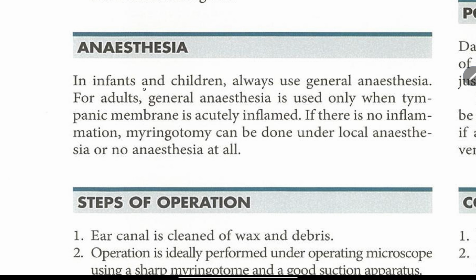Anesthesia. In infants and children, always use general anesthesia. For adults, general anesthesia is used only when tympanic membrane is acutely inflamed. If there is no inflammation, myringotomy can be done under local anesthesia or no anesthesia at all.